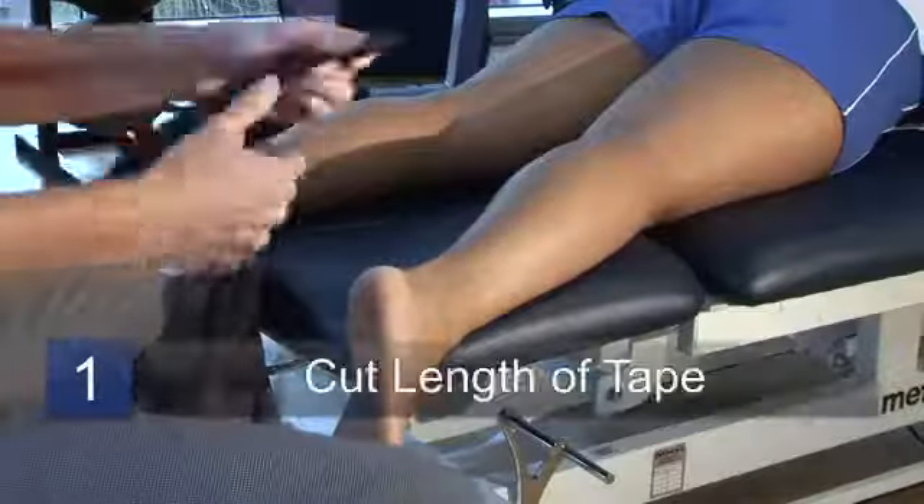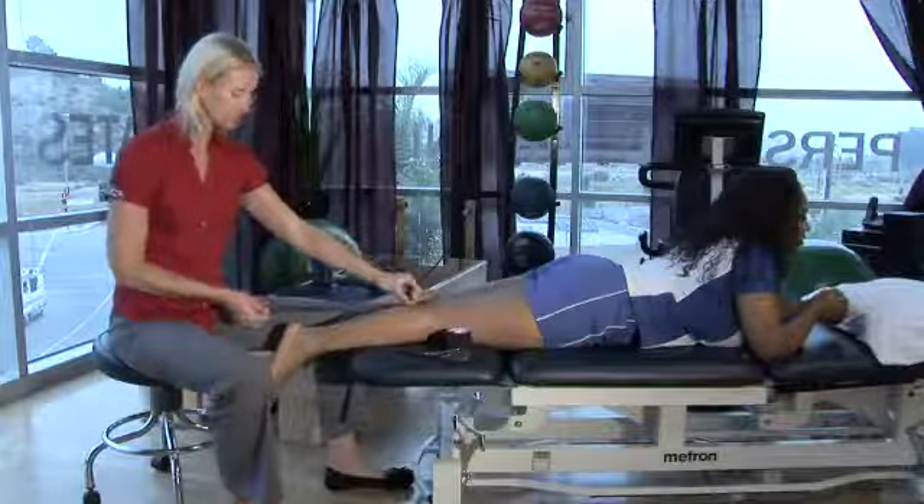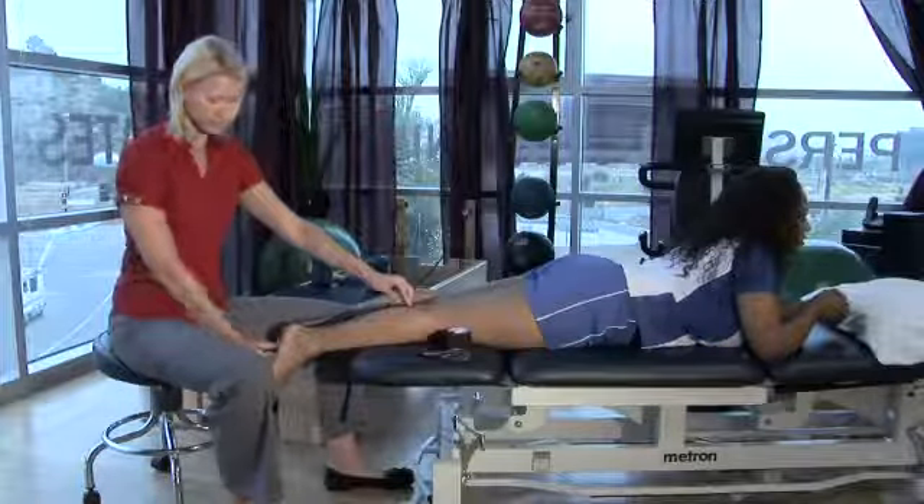You want to cut it the length from about an inch below the popliteal space, and then let it come all the way down around the heel.